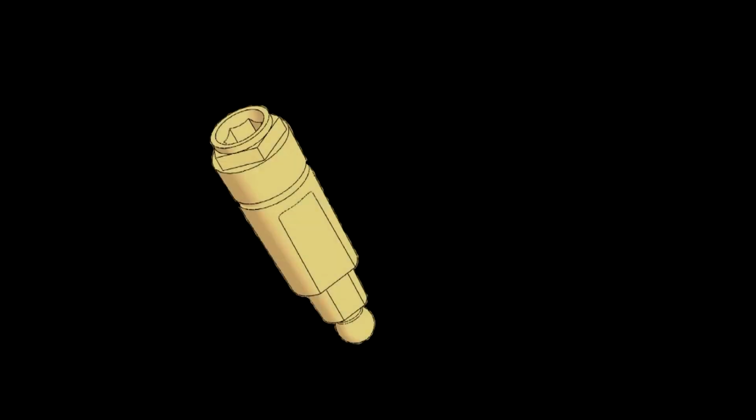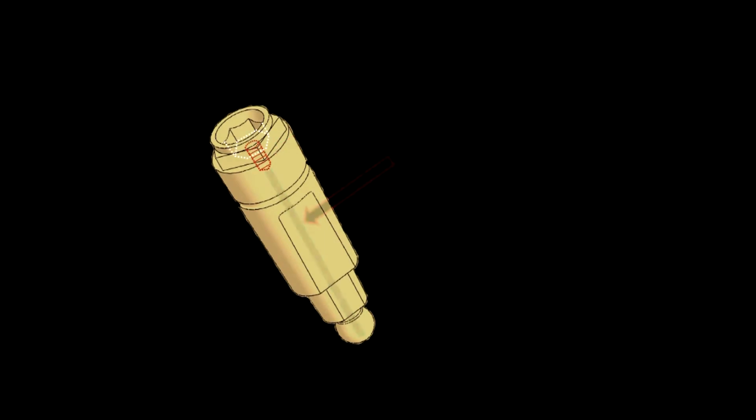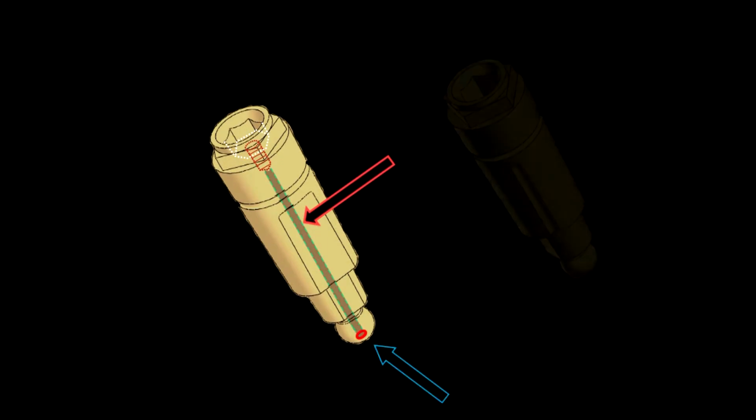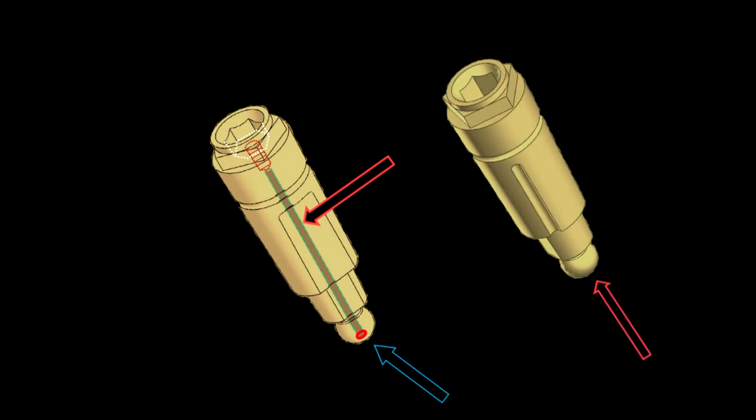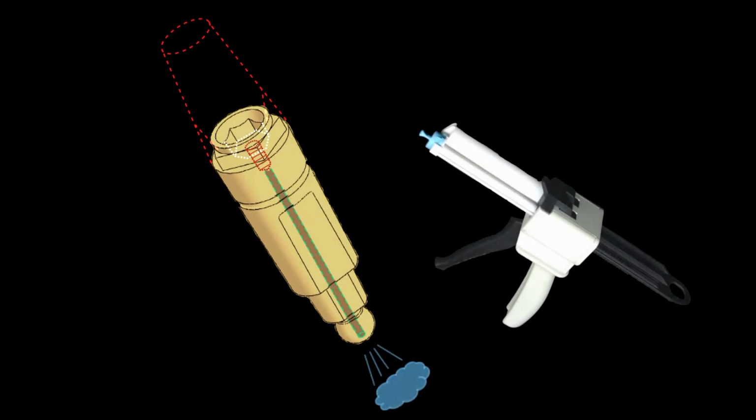Inside the analog, the usual inlet opening for the fixing screw has continuation along the entire analog body and ends with the outlet opening at the base of the spherical ledge on the analog apex. Such design is critical for improving the process of obtaining a duplicate, namely because it provides an air outlet when injecting the duplicate material and avoids the formation of air pockets.